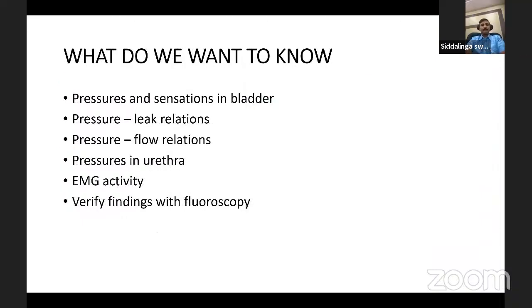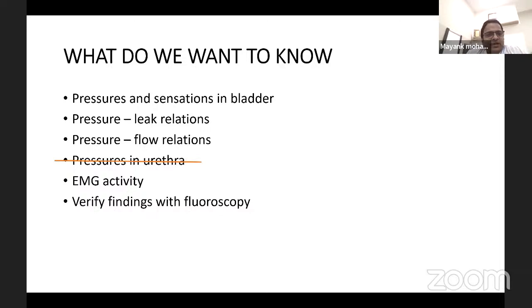So once we know about this basic setup, what do we want to know in a urodynamics? Now we want to know essentially pressures and sensations in the bladder, how these pressures and urinary leak relate to each other, how these pressures relate to flow, like uroflowmetry with pressure studies. Then pressure in the urethra, EMG, and fluoroscopy come next. I will not be talking about pressures in the urethra because that would make it a little more cumbersome to understand, not too much in one go.